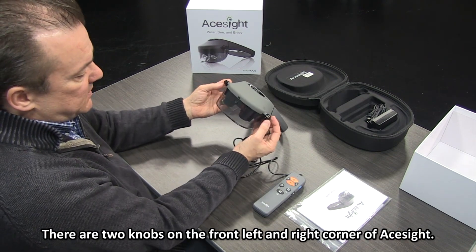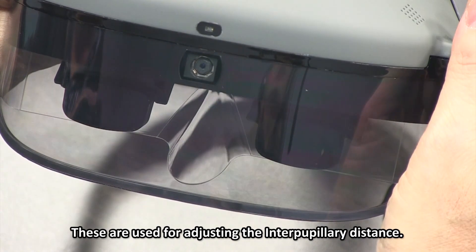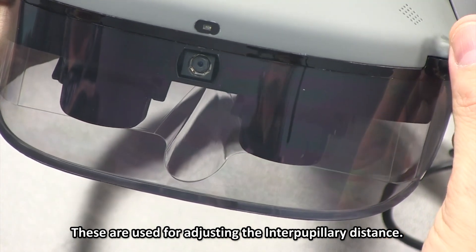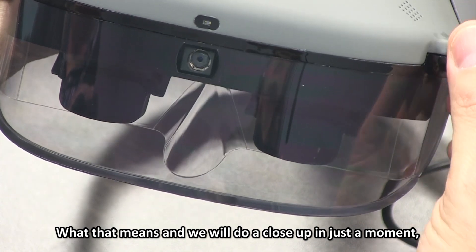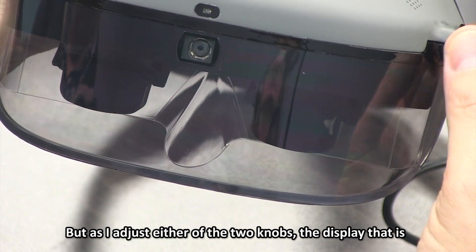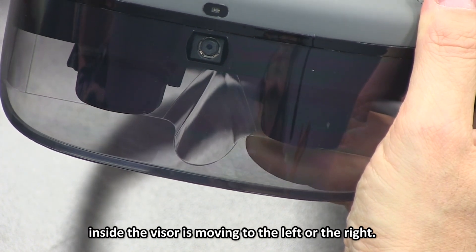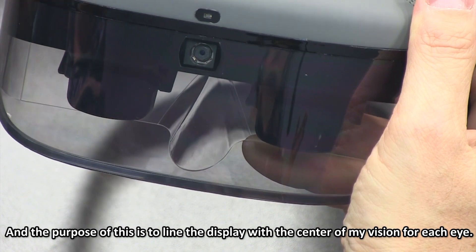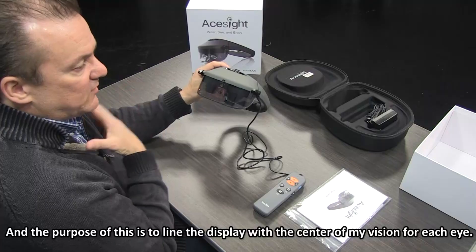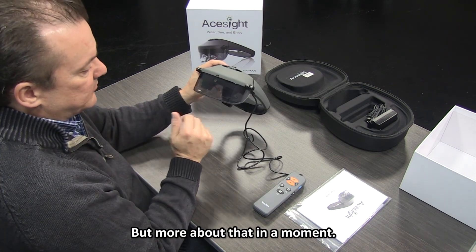There are two knobs along the front left and right corner of ACE Sight. These are used for adjusting the interpupillary distance. As I adjust either of the two knobs, the display inside the visor moves left or right. The purpose of this is to line the display with the center of my vision for each eye — more about that in a moment.